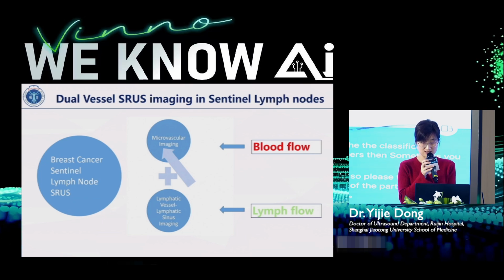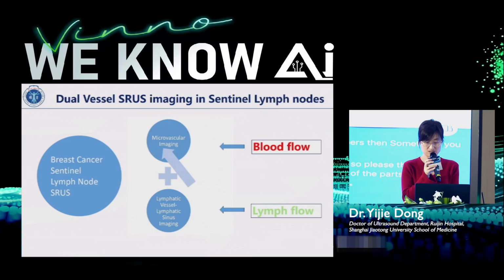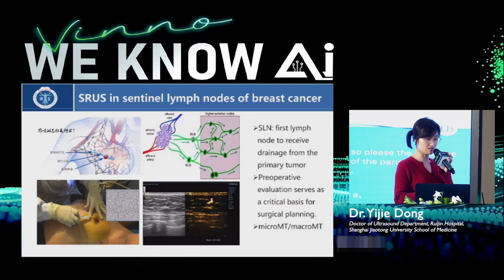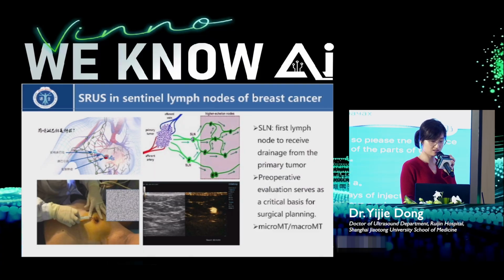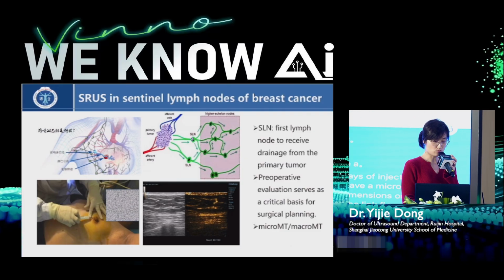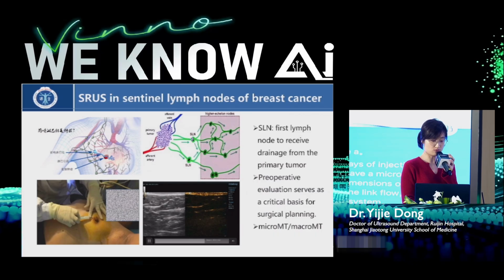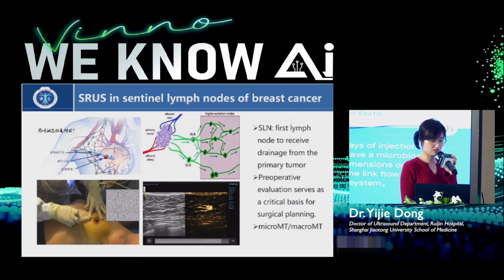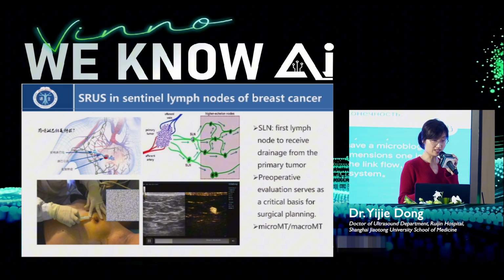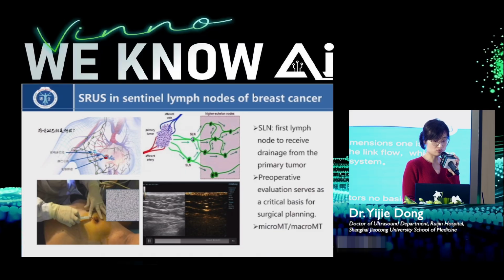So for the next part, let's focus on breast cancer sentinel lymph nodes. I don't know if any doctors know this technology, that we can inject the microbubbles intradermally. In this way, we can have a very clear background of contrast-enhanced images. It can just show the lymphatic tract and the lymph nodes, with no other complex background of tissues.